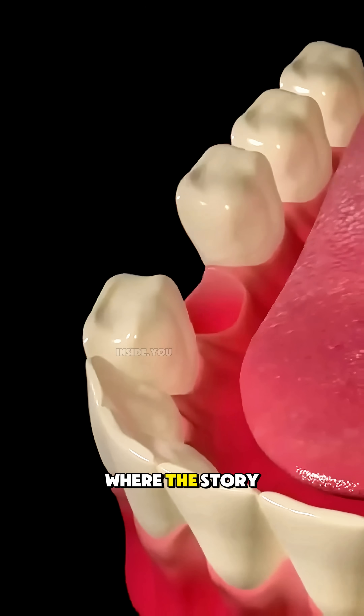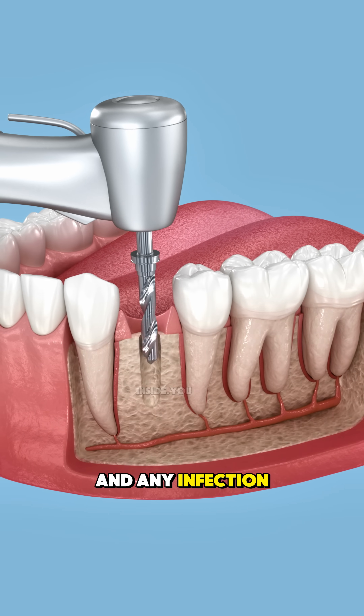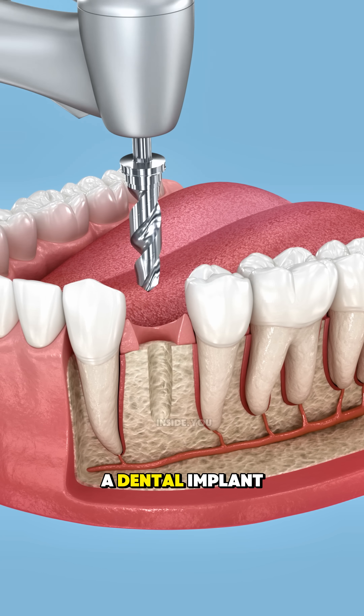But that's not where the story ends. After the extraction, the socket is cleaned and any infection or debris is removed to prepare for the next step — a dental implant.